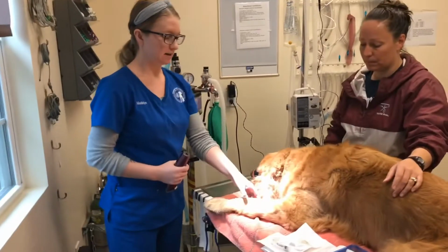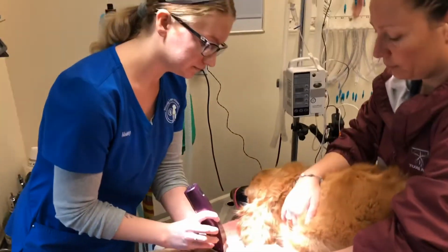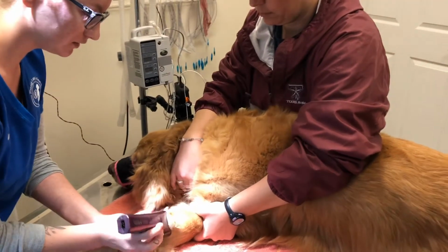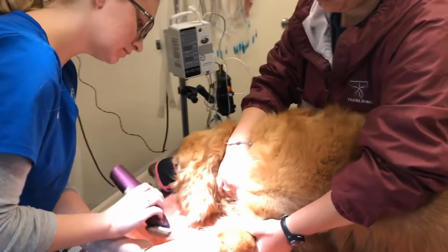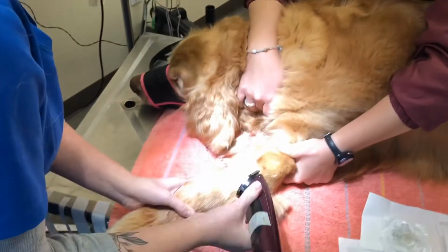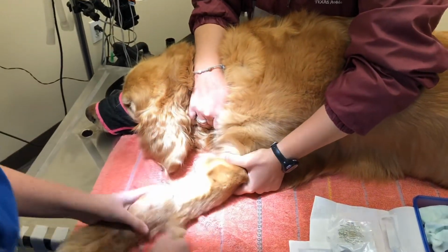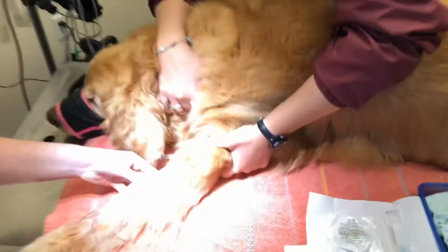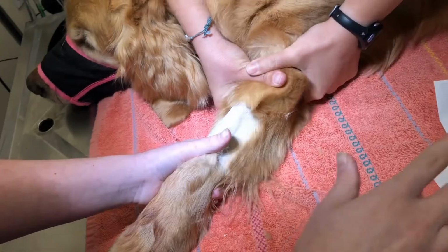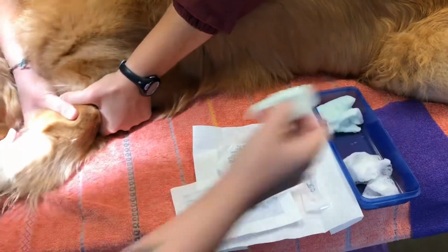I'm going to start by taking my front arm and shaving a small square where the cephalic vein should rest. I already have my supplies laid out here, so I have some chlorhexidine scrub and some alcohol, and we'll go ahead and clean our site next.